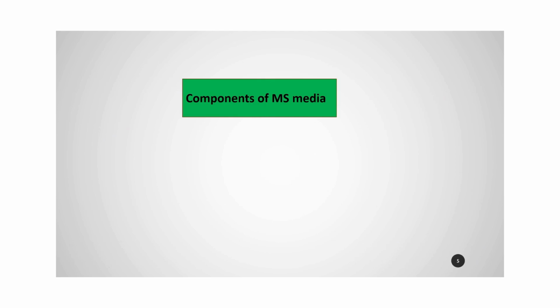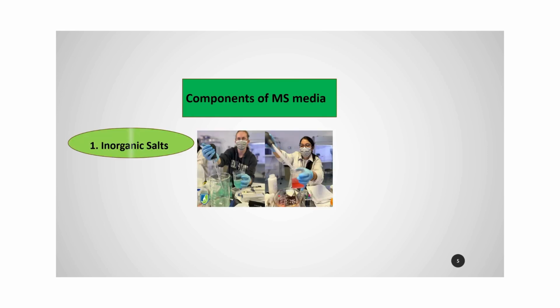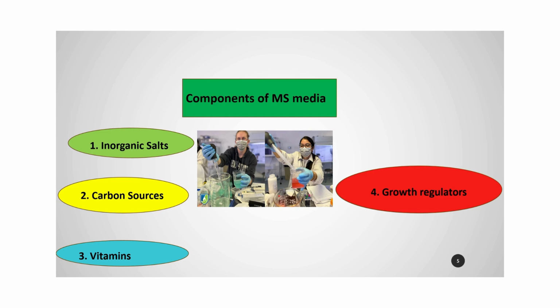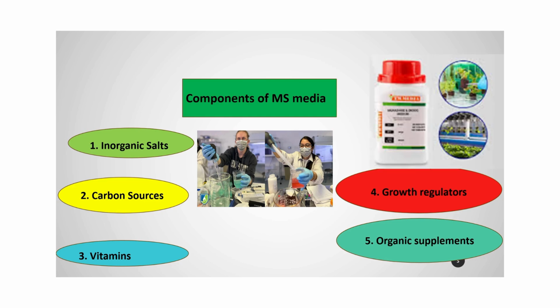Components of MS media. When we talk about components, number 1, inorganic salts, carbon sources, vitamins, growth regulators, organic supplements, and media for plant tissue and cell cultures.